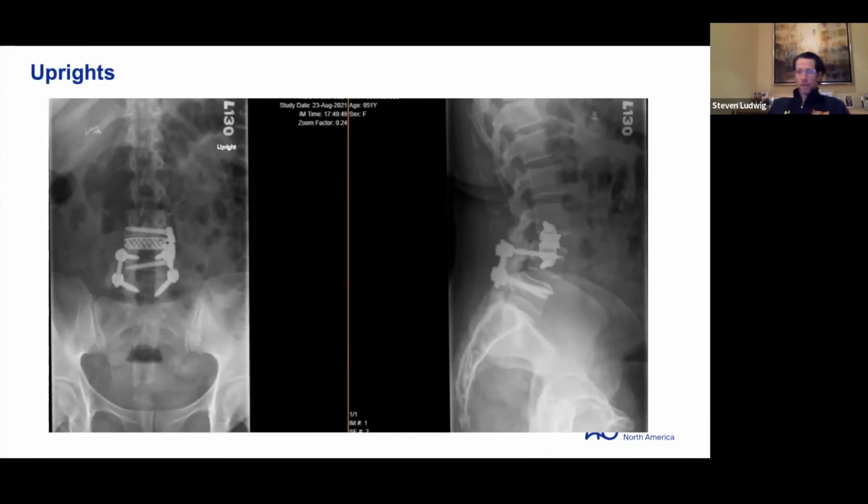However, to your point, astutely, Eugene, in the face of osteoporosis, if you're going to do an interbody, because the posterolateral fusion bed is compromised and it's a more challenging, harsher fusion environment, the patient is osteopenic or porotic, and you need to enhance the ability of the spine to fuse, I would do an interbody, probably through a posterior approach or a TLIF approach, or even a prone lateral-based approach as well that I think we're going to talk about next, maybe an option as well, but I would add pedicle screws. So I think bone quality and the level of the spine plays a role in the decision-making.